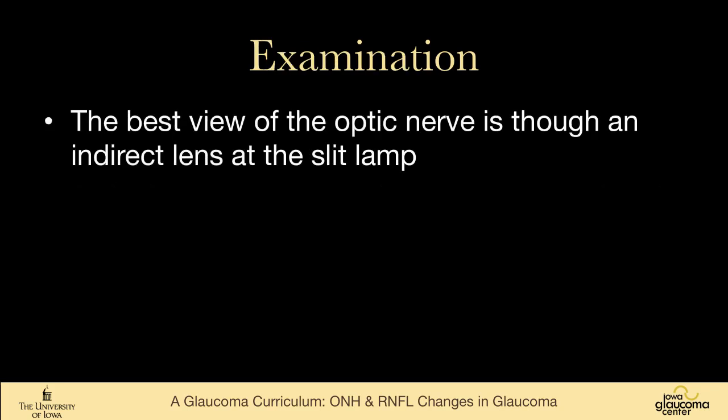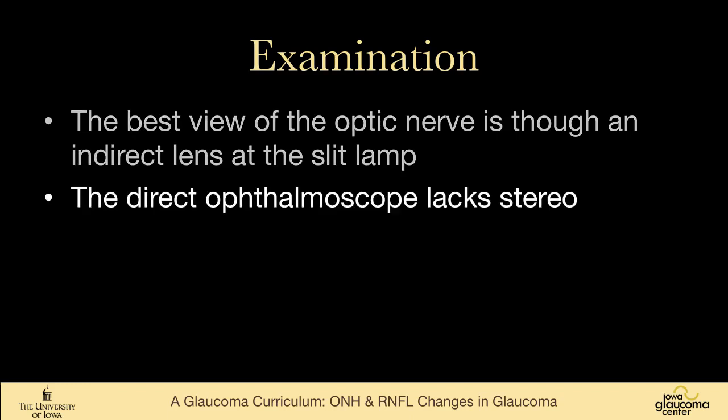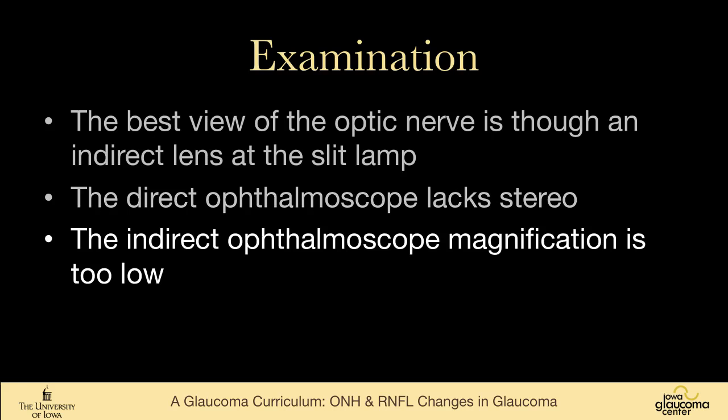I think most of us would say that the best view is through an indirect lens at the slit lamp. The direct ophthalmoscope lacks stereo. It's very magnified, and I think for an ophthalmologist is not a great tool for looking at the optic nerve. The indirect ophthalmoscopy has such a low magnification that it really is not a great tool either for looking at the optic nerve.